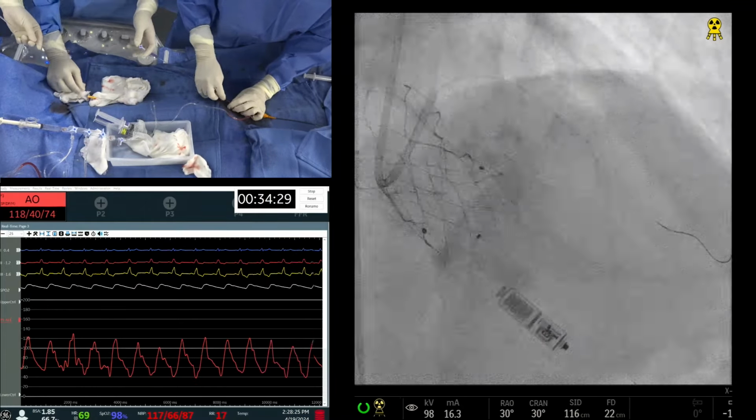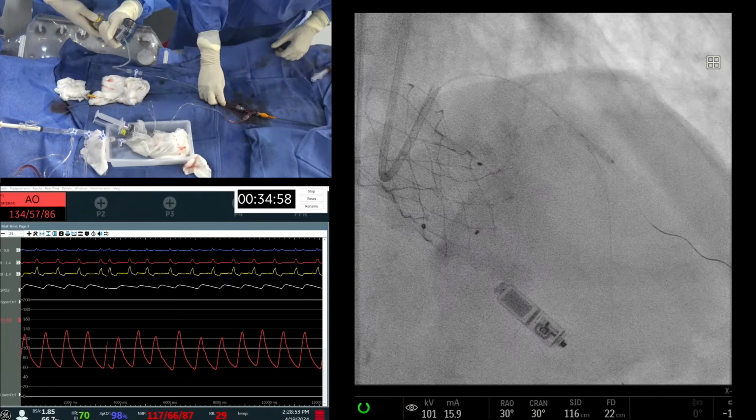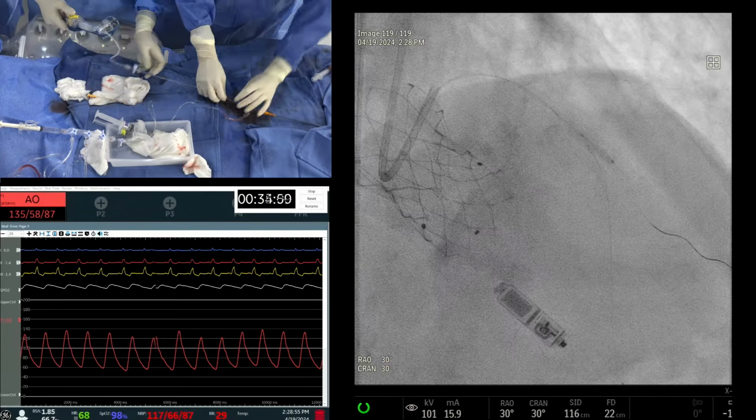Now your 2.5 IVL should be ready, please. The question is, do you want to IVUS the side branch? It slid down beautifully. Yeah, I guess you don't even need IVL. No, we'll need the IVL. There's still more calcium. Although it opened up nicely, I think we should do the ostium. Hold on, IVL 2.5, no, I think, you know what, get the IVUS catheter. 2.5 or 2.75 IVL. Before that, I think it's good that we image.